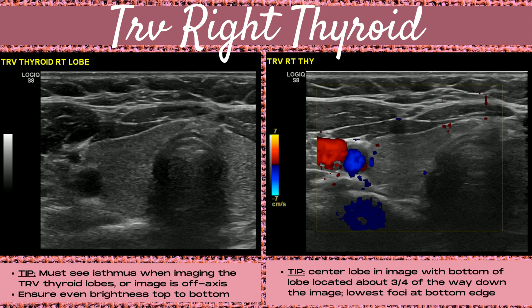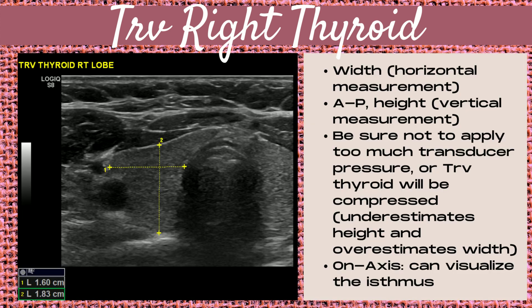Now moving on to the transverse right thyroid lobe. You must see the isthmus when imaging the transverse thyroid lobes or the image is off axis. Ensure that your thyroid lobe has even brightness from top to bottom. Center the lobe in the image with the bottom of the lobe located about three-quarters of the way down. Use multiple foci — typically two for a thyroid study — with the lowest foci placed at the bottom edge of the thyroid lobe. When measuring, perform a width measurement (horizontal) and an AP or height measurement (vertical). Do not apply too much transducer pressure, or the transverse thyroid will be compressed, underestimating the height and overestimating the width measurement.